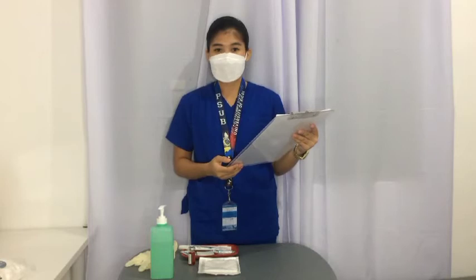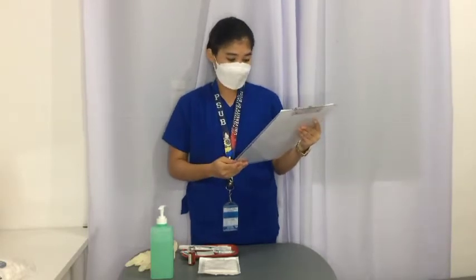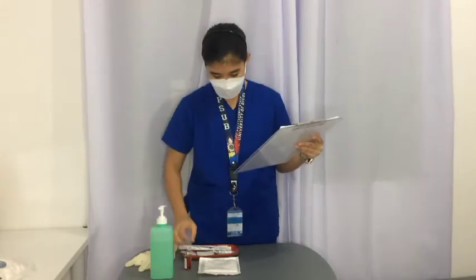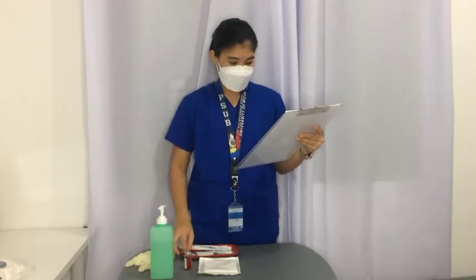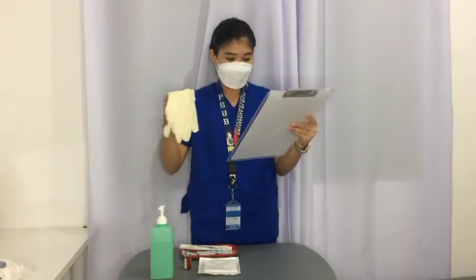So next is the assembling of equipment and supplies needed for this procedure. So I have here the medication administration record or the computer printout. I also have the vial of sterile medication, the syringe and needle of a size appropriate for the amount of solution to be administered, the antiseptic swab, and also the clean gloves.